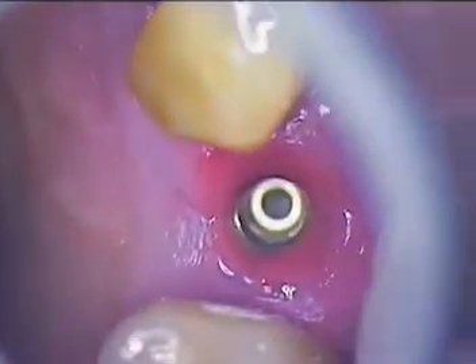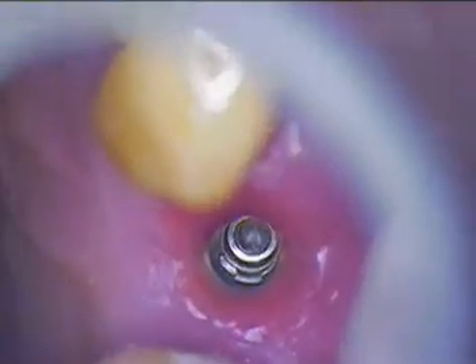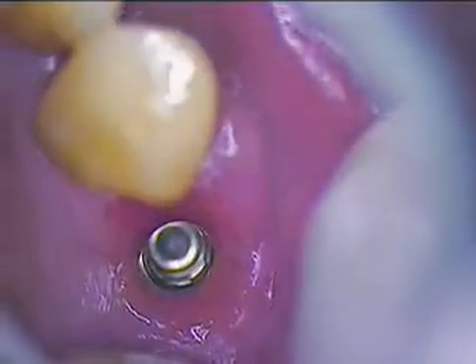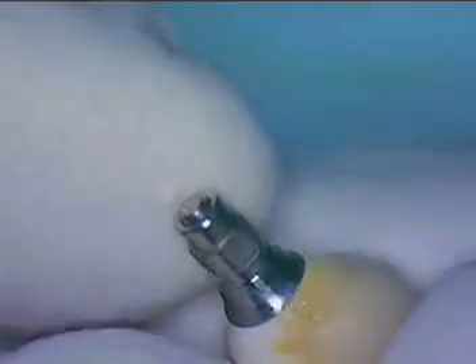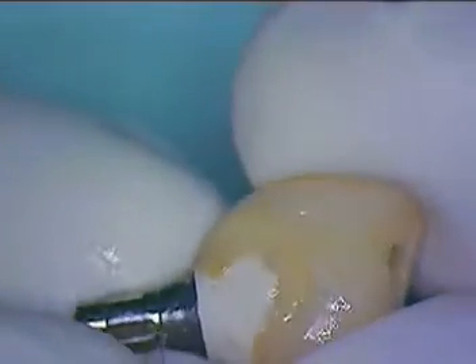Nice adaptation right to the top of the implant head — that looks really good. Luigi agrees it looks pretty good. This is the temporary, and care was taken to make sure the underside was polished. We put that back in and got a little better tissue response this time.